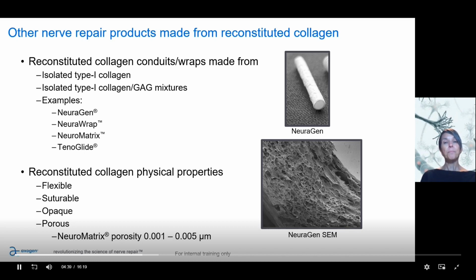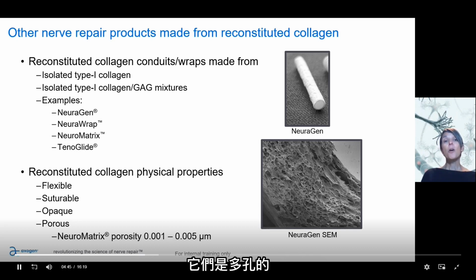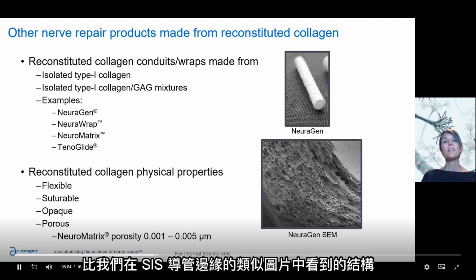These conduits are flexible, they're suturable, but they are opaque. They are porous, but their porosity is much smaller than what you see with the SIS material. You can see here, this is the edge of the Neurogen material in the picture on the bottom. That is a much tighter structure than what we saw in the similar picture of the edge of the SIS conduit.